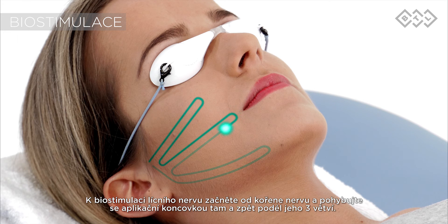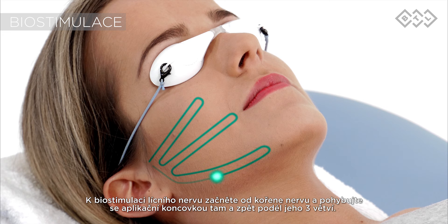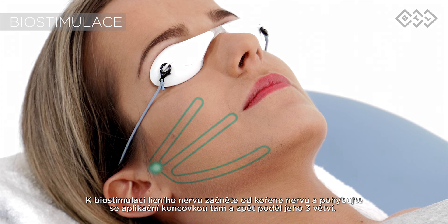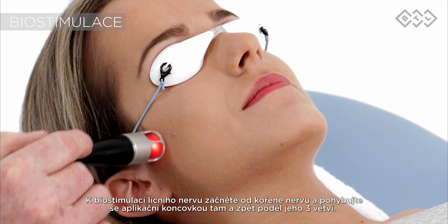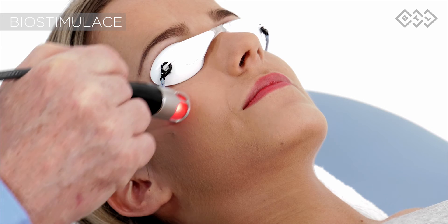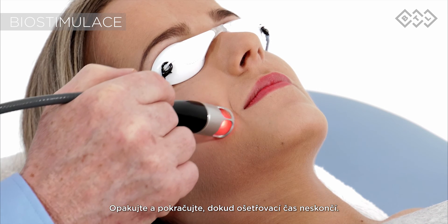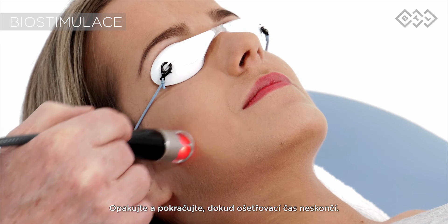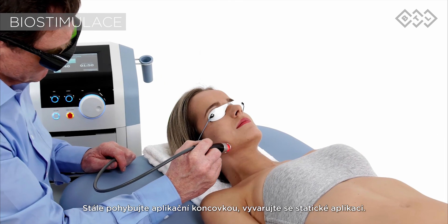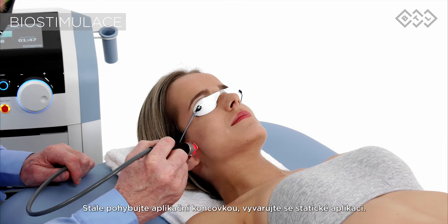To biostimulate the facial nerve, start from the facial nerve root and move the applicator back and forth along its three branches. Repeat and continue until the therapy time is up. Keep the applicator moving and be sure to prevent static application.